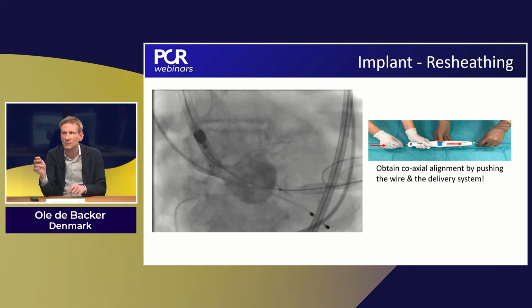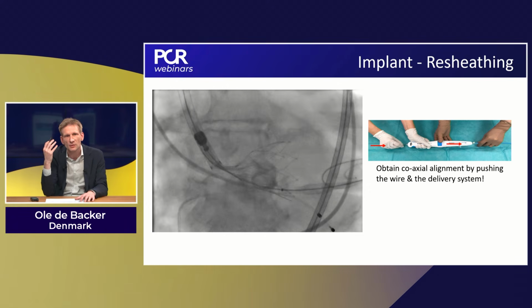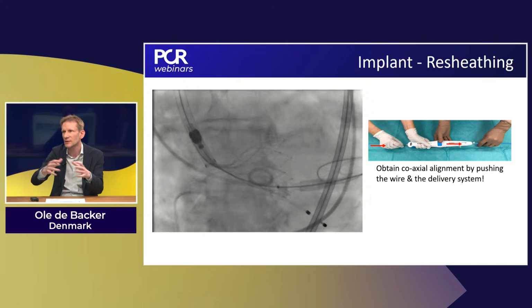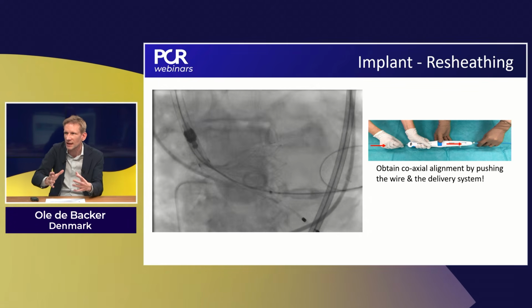So indeed, it's completely correct, but you can anticipate it, and many forget that, in fact, these tall frame valves will always follow the aorta with the final release. That's why they sometimes also cant a little bit.